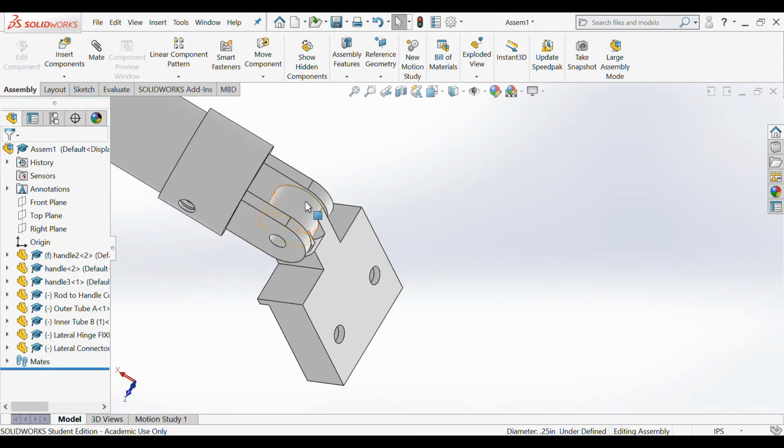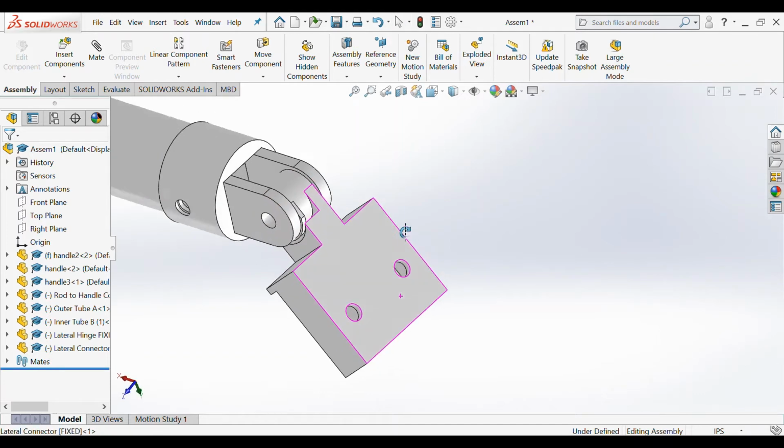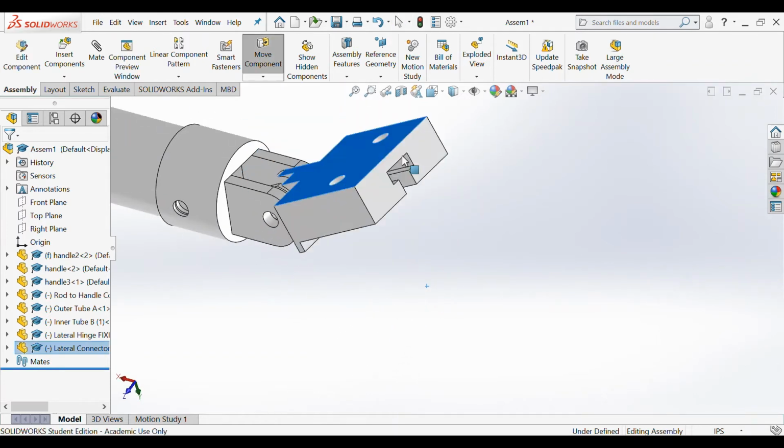So the concentric mate made the holes aligned, while the width mate held this piece in between these two pieces with equal distance from here to here and from here to here, which will allow this hinge piece to move up and down like so.